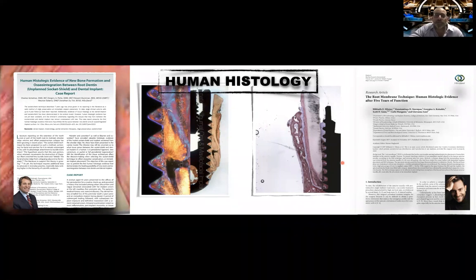And it's not a partial extraction therapy lecture per se, so I don't want to get too detailed into the concept of what partial extraction therapy is, except to say that we're retaining part of that buccal plate of the root, and we are going to have a remaining shield, so to speak, or membrane of tooth that's going to remain to help keep this periodontal ligament intact.